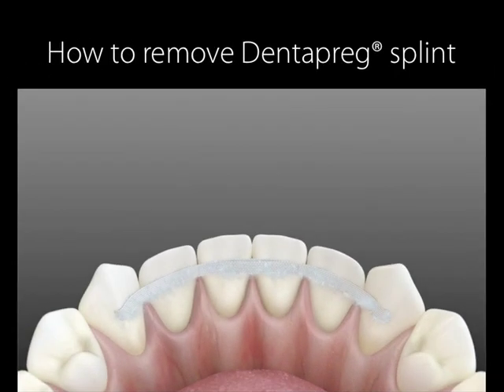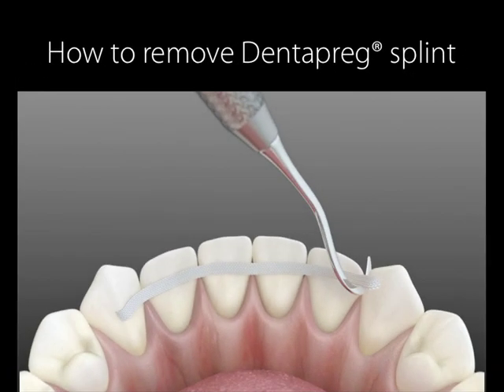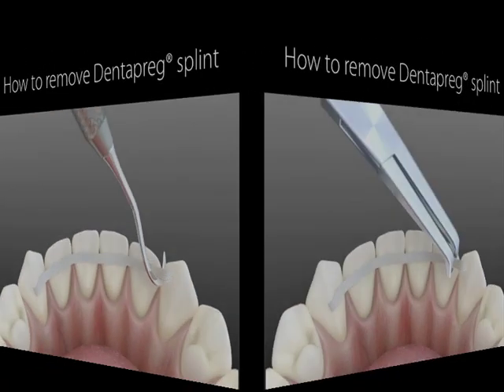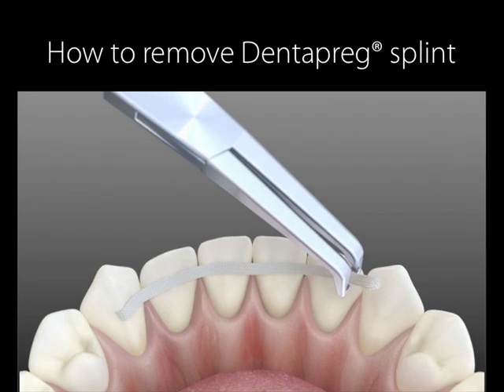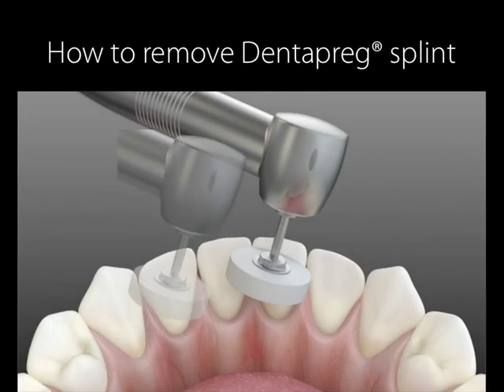Next, you should remove the strip from the tooth surface. This can be done in two ways. If you have orthodontic pliers, they may be used as well, pulling from the interproximal spaces. Finally, you'll just want to clean and polish the teeth.